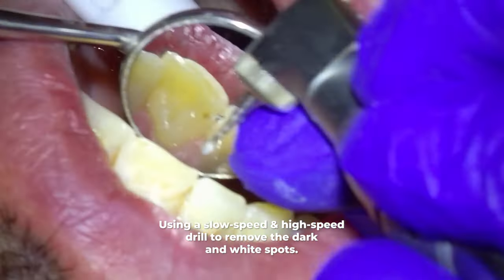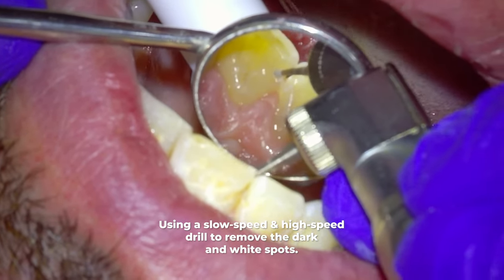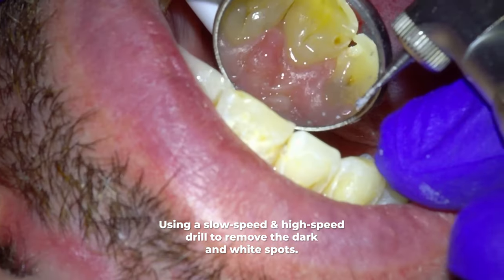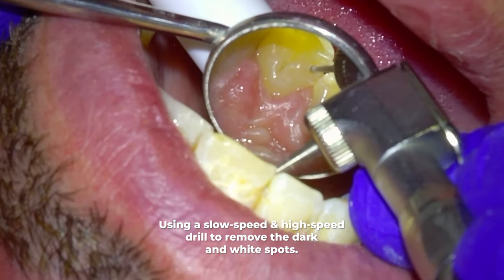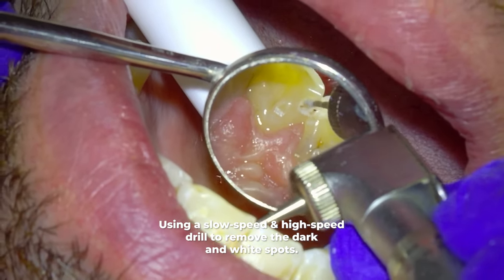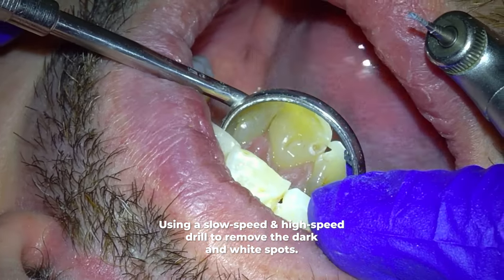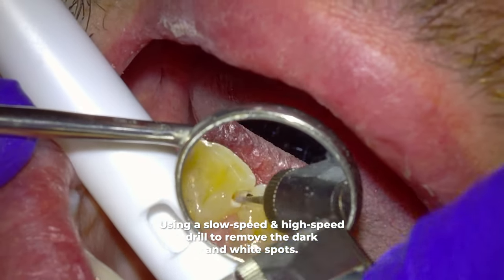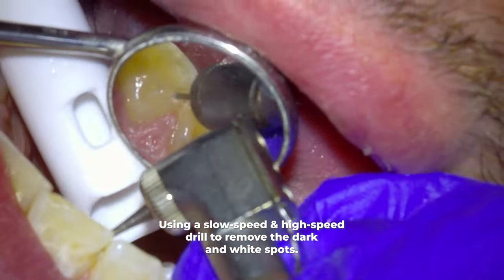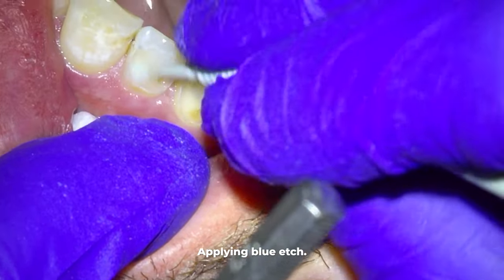Just one note: you might notice there are still white spots on this tooth — we're only removing the decay because the filling isn't going to sit in the middle of those white spots. Once again, because the patient liked the way this looked, we do remove these white spots in the next appointment. One thing you may start to notice is the white spots getting more apparent throughout the tooth during the procedure — we will explain that later. Now we're close to the end of the drilling, but before filling the teeth I lightly run over where the cavities were with the slow speed drill one last time to ensure they are solid with no decay left behind.